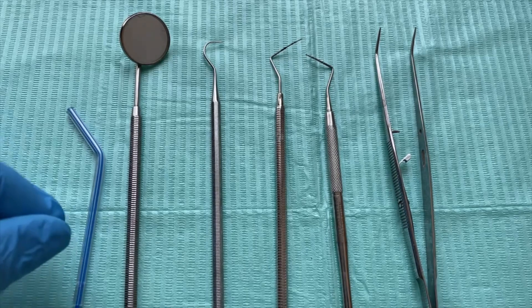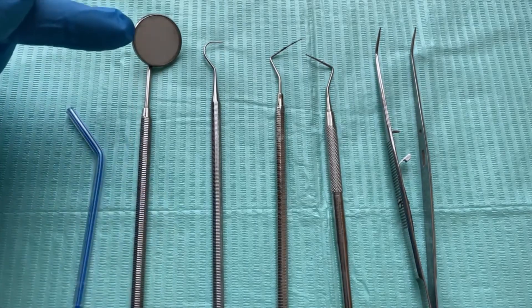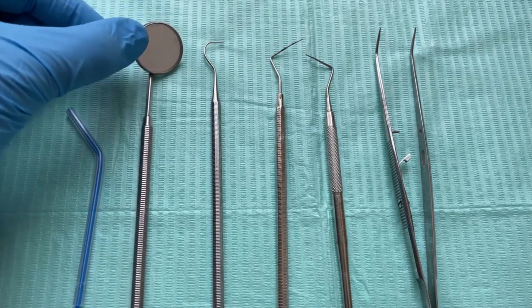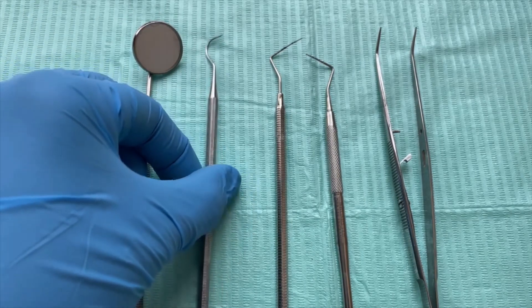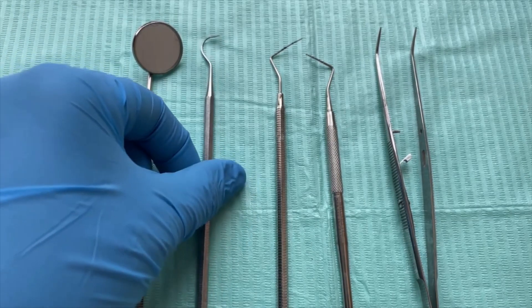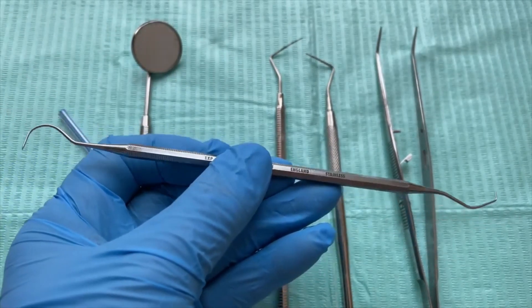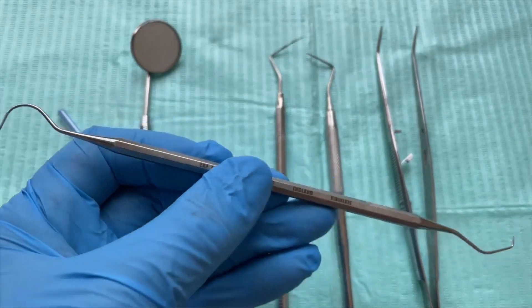So let's go ahead. What you need is a mouth mirror, which is this one here. And you have an explorer or a probe — some countries call it a probe. This is an explorer. If you can see, it has two different ends: you have the sickle end, that end there, and you have the Briault end.